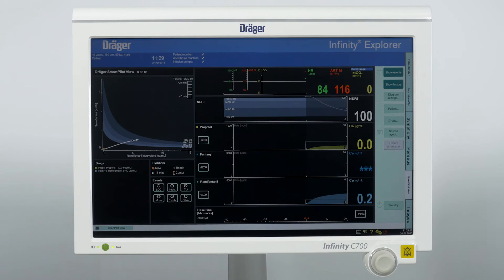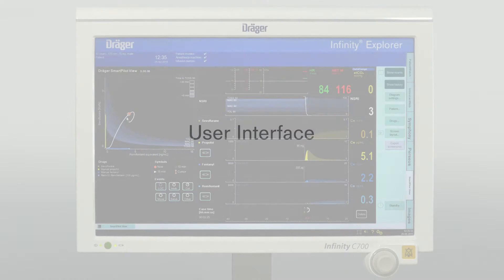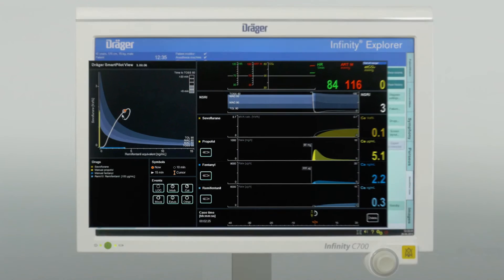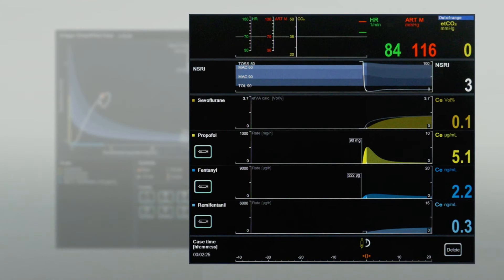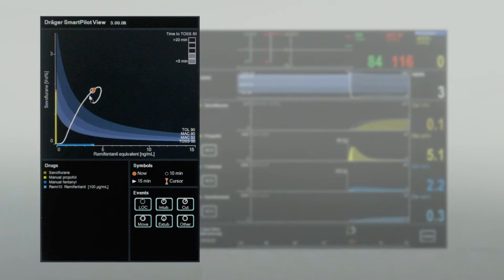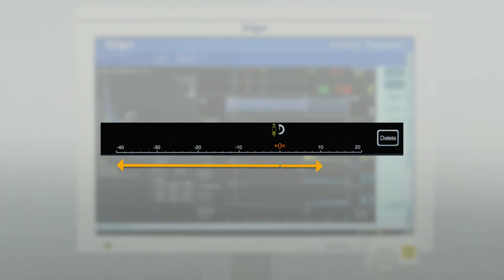Now SmartPilotView is active. On the top blue bar, the patient data and system components overview are shown at a glance, and time is automatically taken from the cockpit. This display consists of two parts: the right side shows the time-based drug data including hemodynamics and trends. Here you will see a timescale for event markers and manual bolus and rate icons. The orange-colored zero represents the current point in time, and for a 60-minute timeframe, you will see a 40-minute trend and a 20-minute preview.